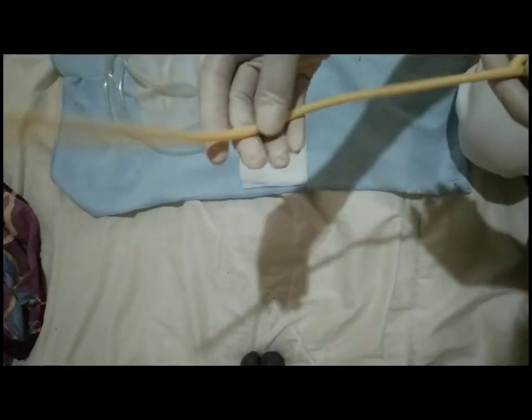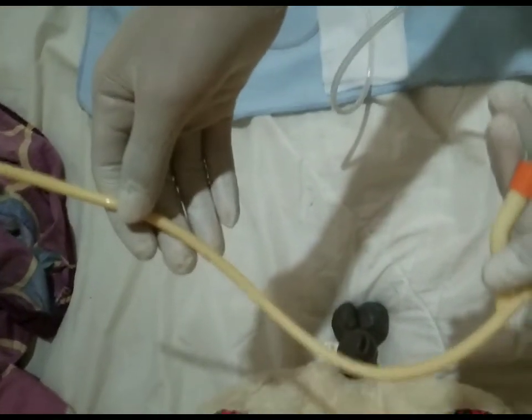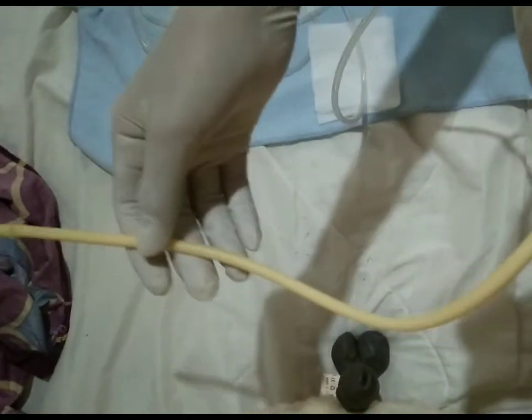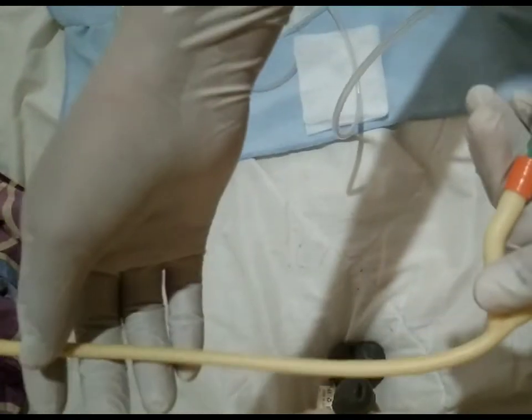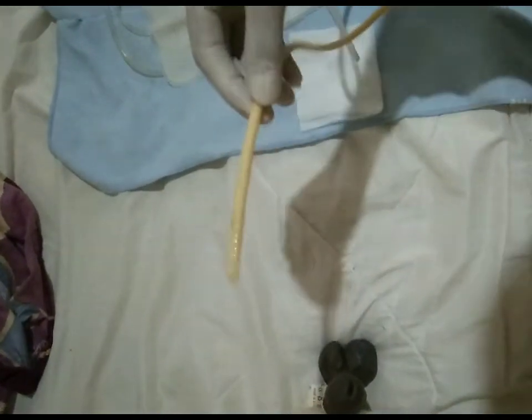Okay, assuming that we already put lubricant on the catheter, and assuming that we already attached the tubing and the syringe on the catheter. So now we will go to the insertion.